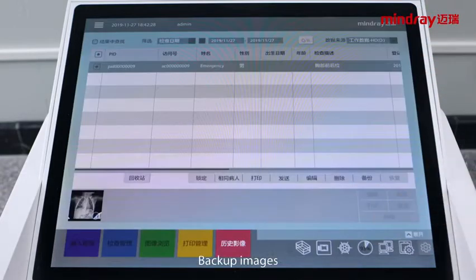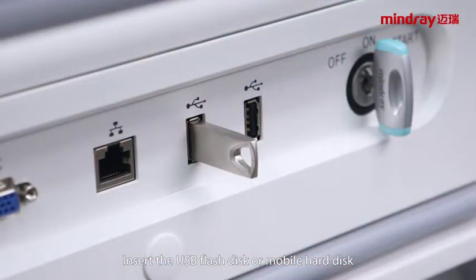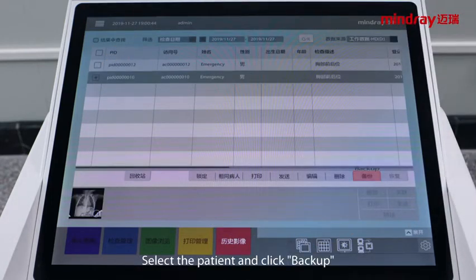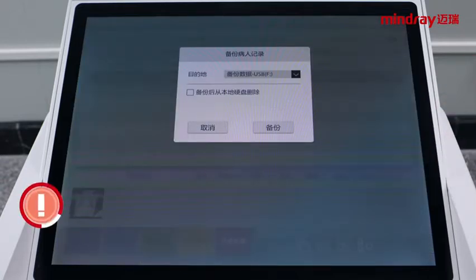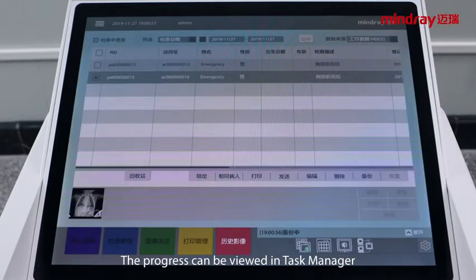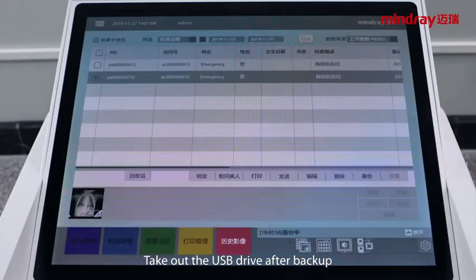To backup images, insert a USB flash disk or mobile hard disk. Click history at the bottom of the touch screen, select a patient, and click backup. Enter the backup patient interface. Note: if you select delete the local image after backup, the image will be deleted. Click backup to start. The progress can be viewed in the task manager. Take out the USB drive after backup is complete.